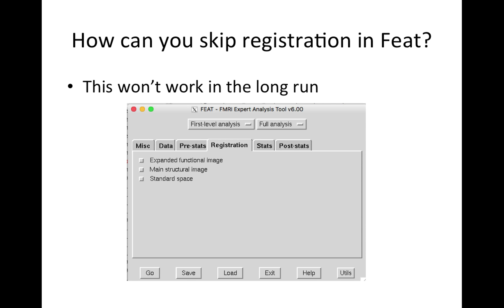That's because FSL runs the first level analysis all in scanner space — that subject's scanner space for that run — and it isn't until the higher level analyses that the registration is applied to the data. It's applied to the cope files and the variance files before running the higher level analysis. So if you have registration turned off, when it goes to apply the registration .mat files, it won't find them and then it will crash.